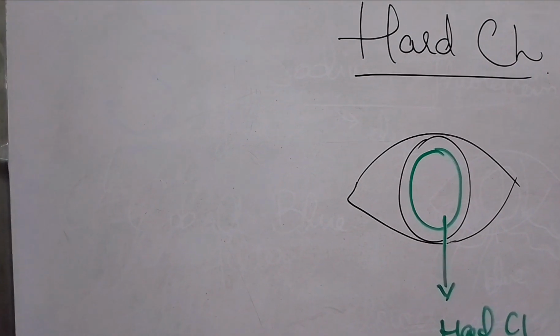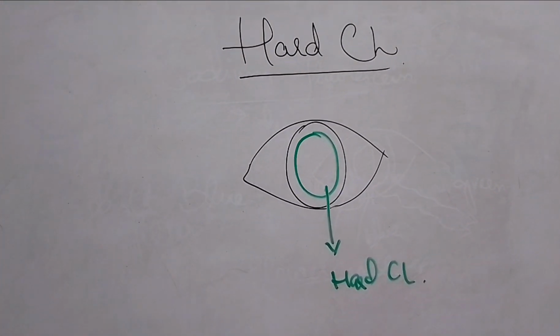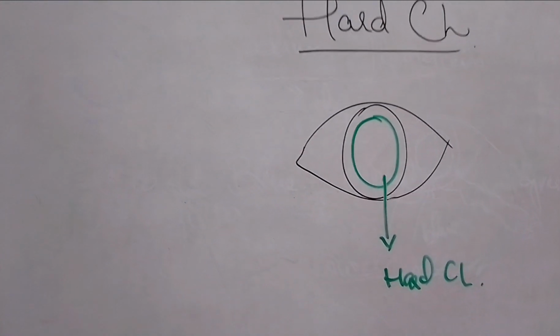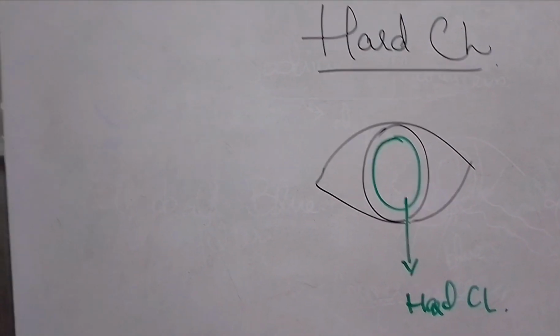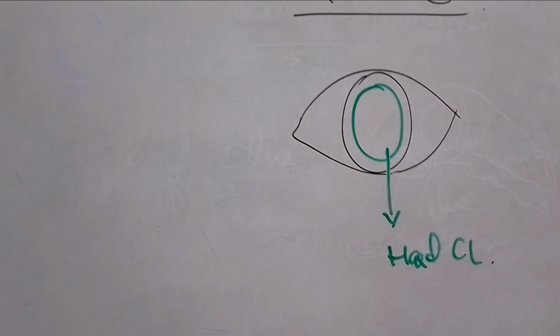While you have placed the contact lens on the surface of the cornea and you want to check whether the contact lens is steep, flat, or optimal, you need to do the fluorescein pattern. You have instilled the fluorescein dye into the patient's eye. Now, what are some important tips you should know for understanding the fitting assessment of the fluorescein pattern, right?